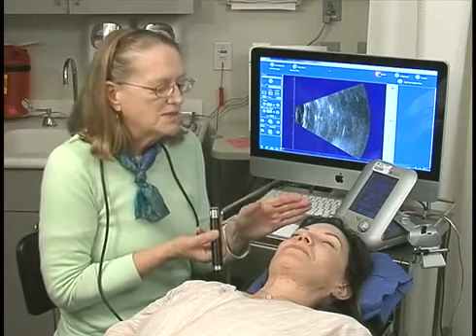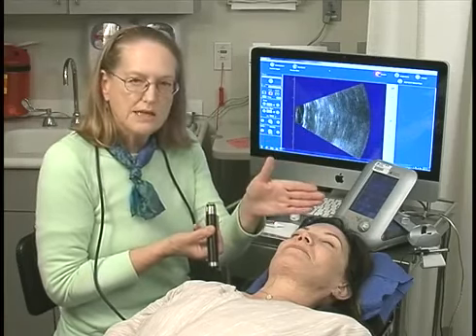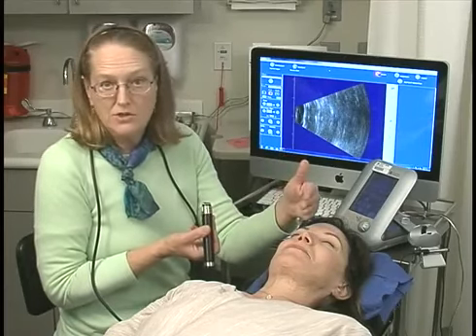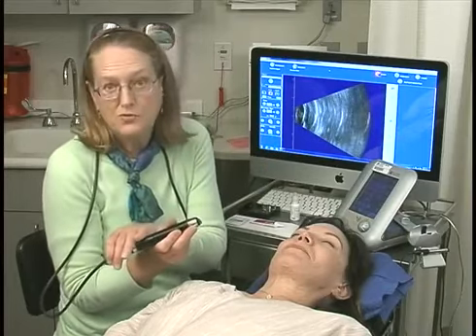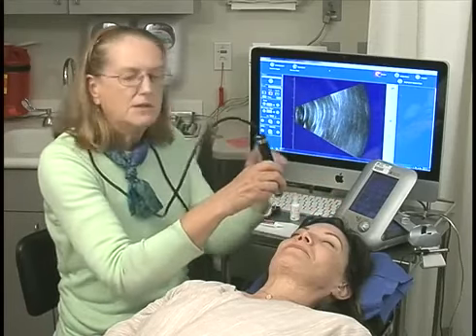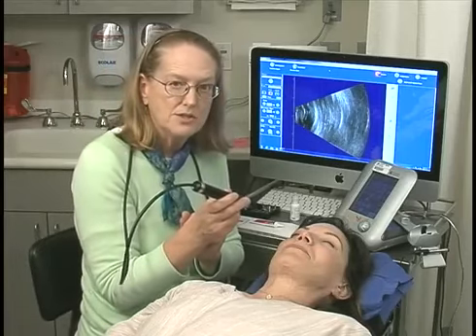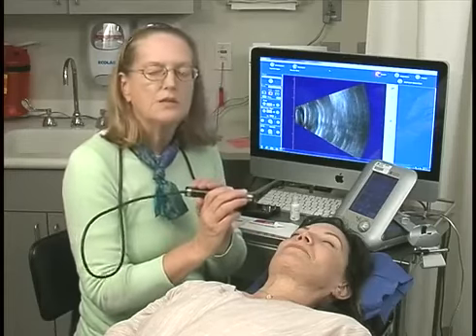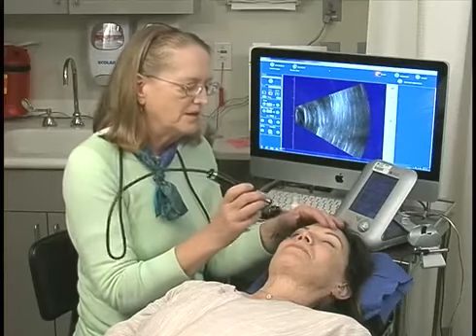But there are times when it's nice to do an axial scan so that we can document the posterior lens capsule in relationship to the optic nerve and if there's another pathology in that view. So let's start with a horizontal axial, the most useful, because when I go horizontally, nasal, temporal, I will at least have the macula in this view. Although I would never make a clinical decision about the macula or the retina from an axial view, because when the lens is visible in our B scan, I don't trust the echoes from the retina completely.